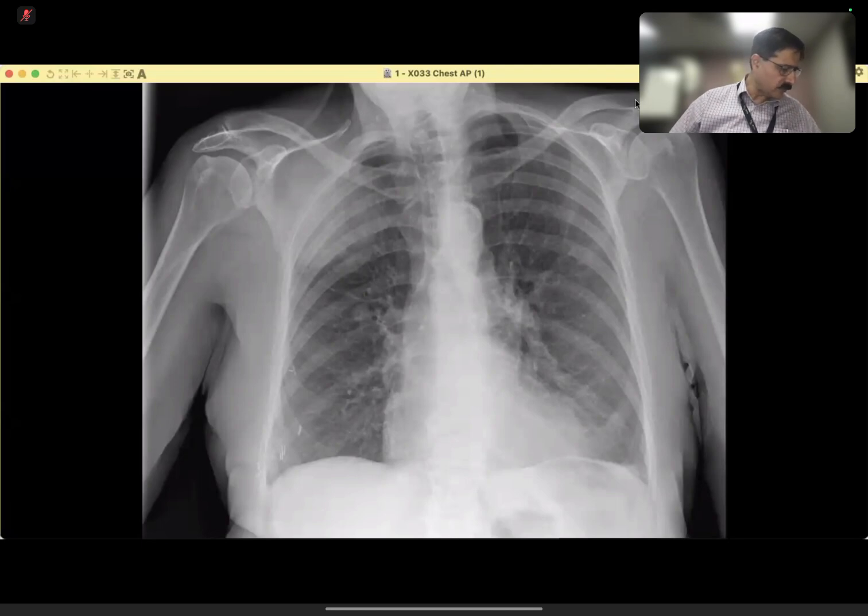This is a 76-year-old female presented to A&E due to an unwitnessed fall. She is confused. She has a history of weight loss, tiredness, anemia. She is not well, but she just fell down, and that is why she came to the hospital. Over to you.